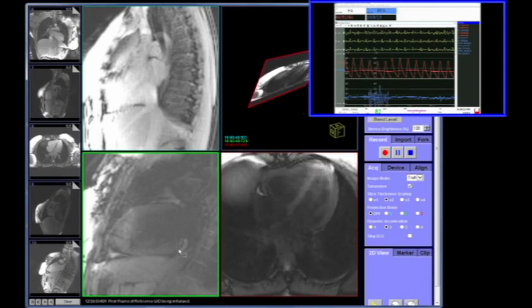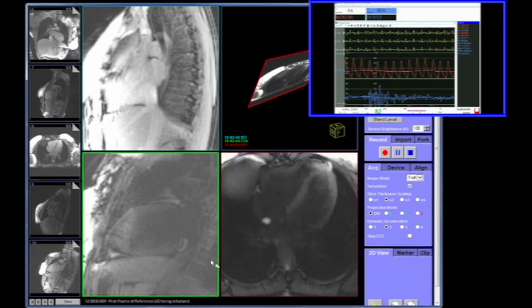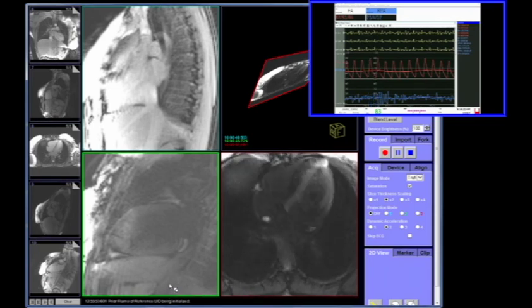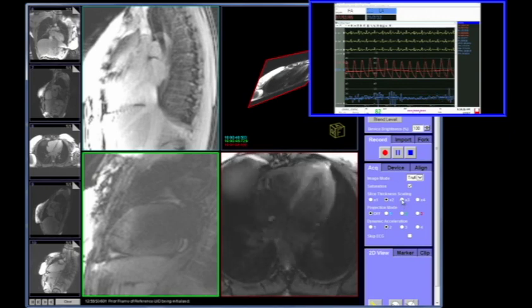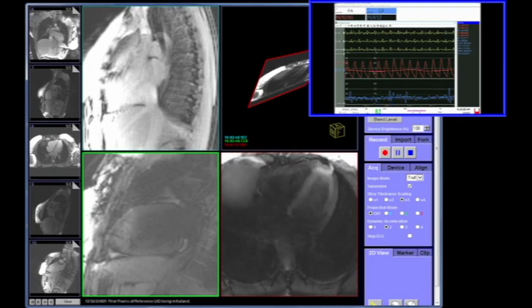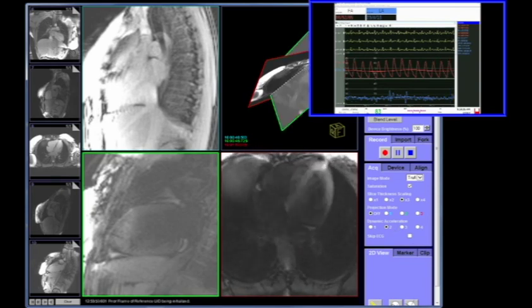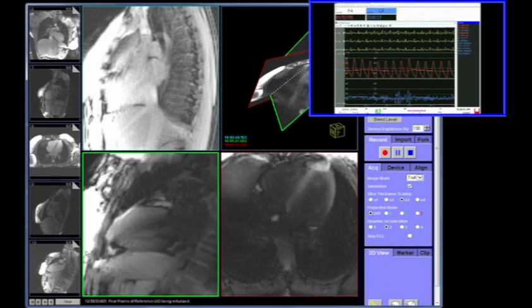We'll come down into the right atrium — there's the balloon in the right atrium, you can see it on the four-chamber view. What you see right now is a four-chamber view; the balloon is the bright spot in the right atrium. This is a standard almost axial plane oriented to the four-chamber view of the heart. Dr. Cantor is attempting to cross the atrial septal defect to obtain a left atrial pressure and potentially an LV end-diastolic pressure.